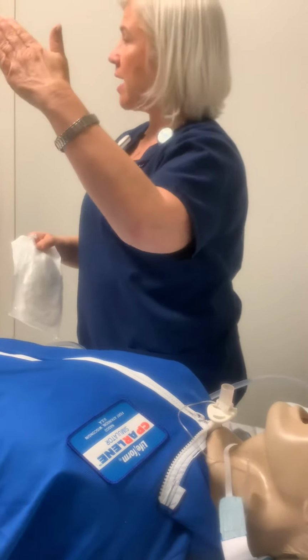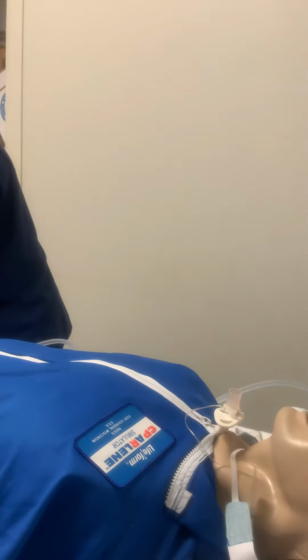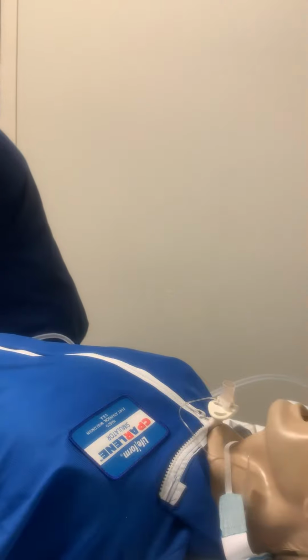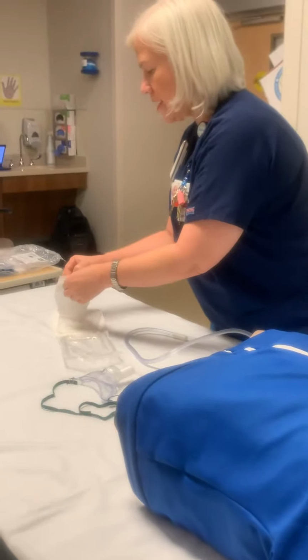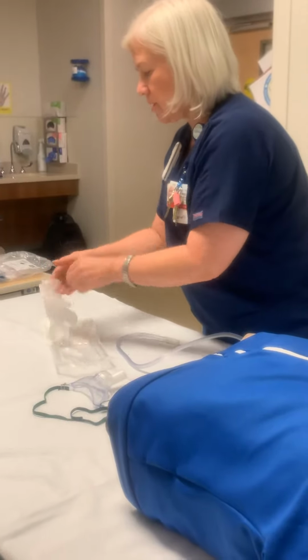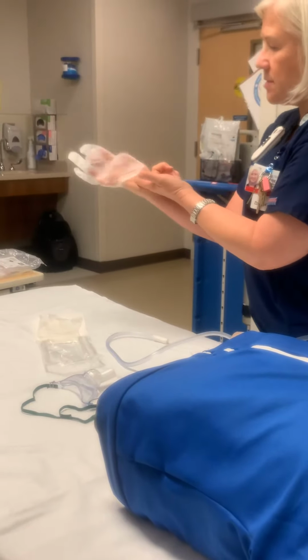I usually like to keep their head up at about 30 degrees when I'm suctioning them. Okay, so you're gonna open this up and this is sterile, all right? So I'm going to take one of my gloves here, and these are vinyls, which is perfect for me because I am allergic to latex gloves.